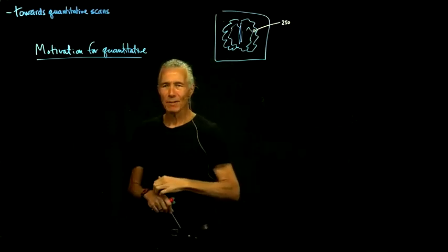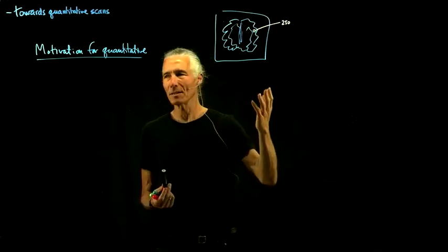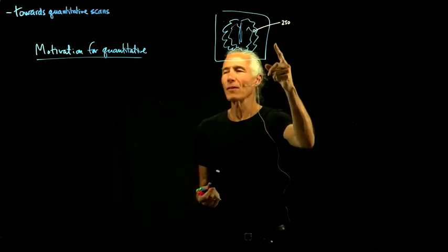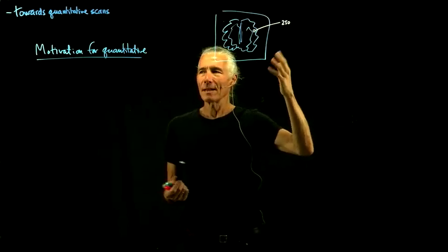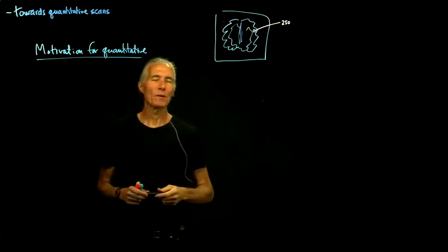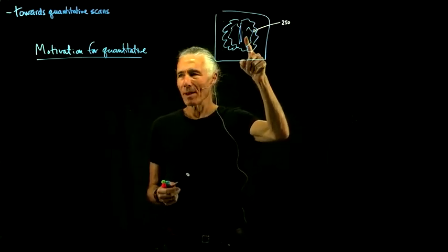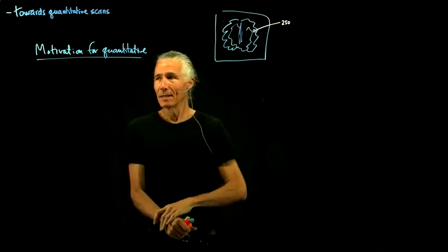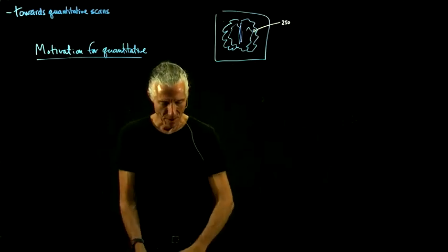And why is that? Well, maybe the person left their big belt buckle on, and it changed the shim. And if you go to another scanner, you might get, say, 11,000. So the actual raw numbers coming out of the scanners are somewhat arbitrary, depending on exactly how they've set up their imaging program. You can easily see that's the gray matter and that's the white matter, using your visual system analyzer, which is really good. But the actual numbers really don't have any direct meaning.